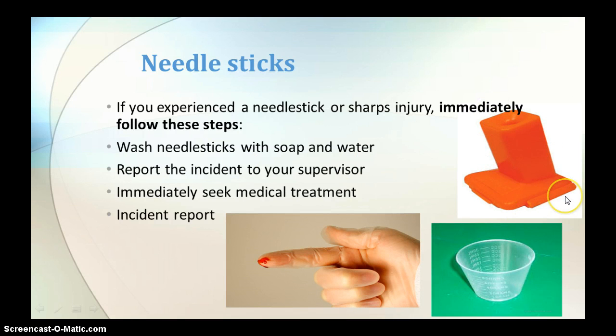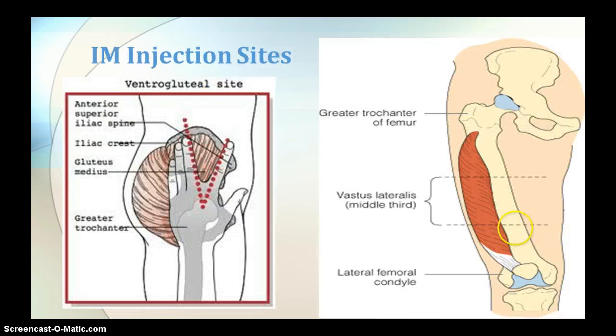This orange device here over on the right is another device where you can actually put the cap of a syringe needle and you can recap it that way. It's a very safe way to do it. You can also use a good old-fashioned med cup. Put a cap in there and recap that way. So be very careful when it comes to needle sticks.